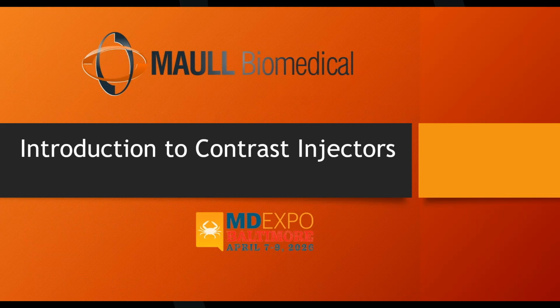I mean, if you think about it, if all the X-rays that go into the patient are absorbed by the patient, that means none of it hits the plate, white image, right? If all the radiation that we fire in the patient passes right through the patient, strikes the entire plate, it's all black, right? So we have to have some absorption and some penetration. All right, everybody get that?